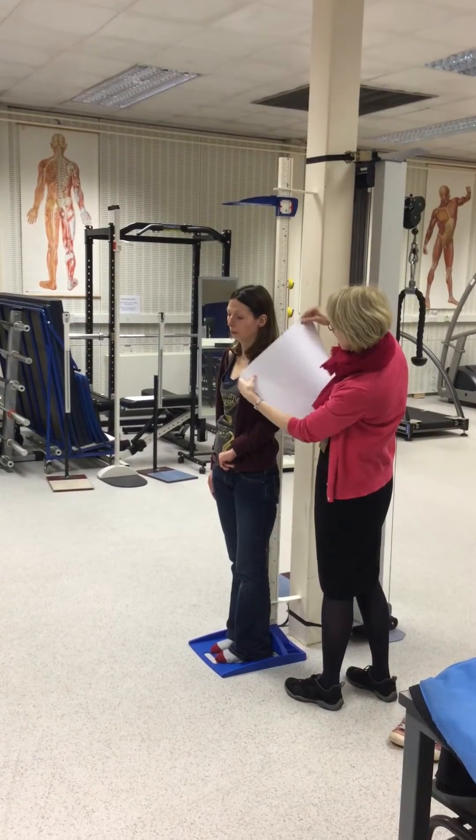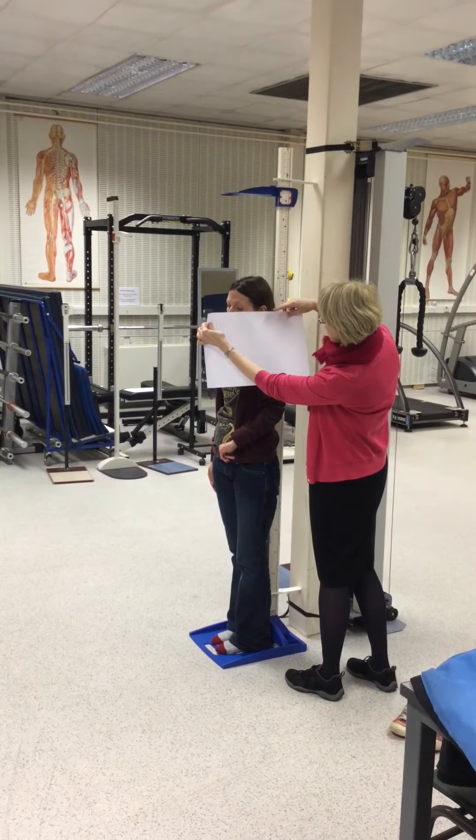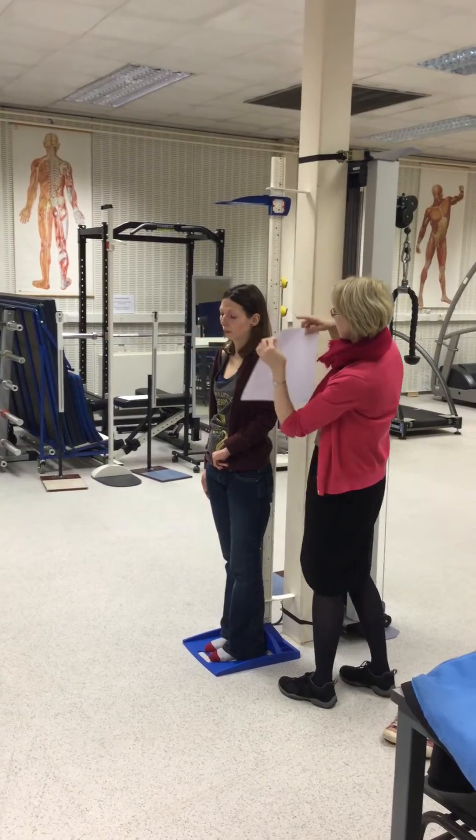So the easiest way to test for that is just to put a piece of paper there. Lee, can you just tip down a little bit? That's lovely. And hopefully then we've got the eye socket and the top of the ear canal matching up. And that looks fine.